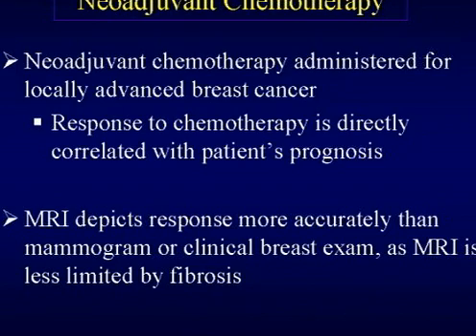And now again, studies have shown that MR is great in monitoring the response to chemotherapy. And in fact, the amount of residual disease that you see in MR can be used to prognosticate how the patient will respond overall. And the reason why MR is so good is because it's not limited by overlying fibrosis, which certainly limits the mammography and clinical breast exam.